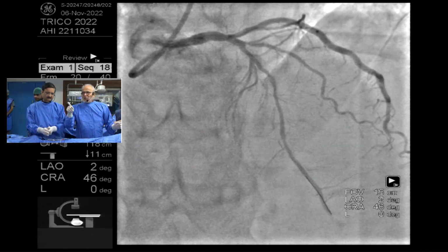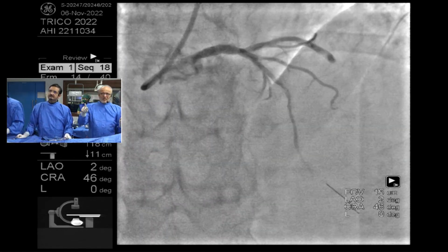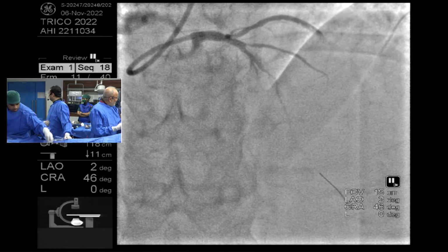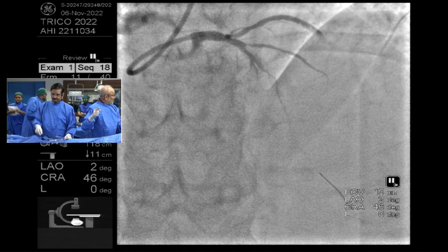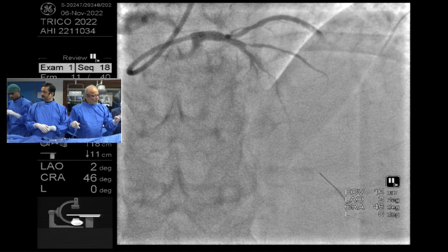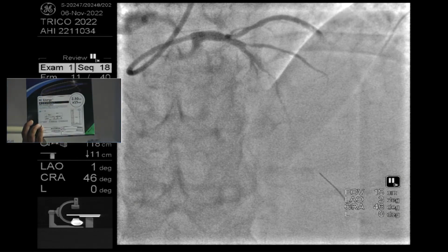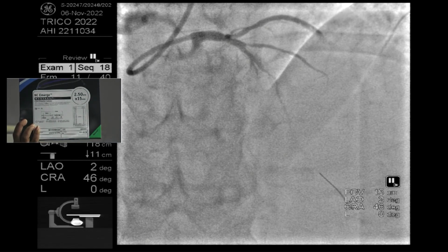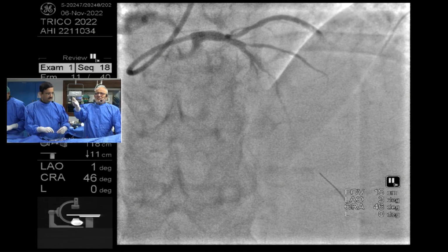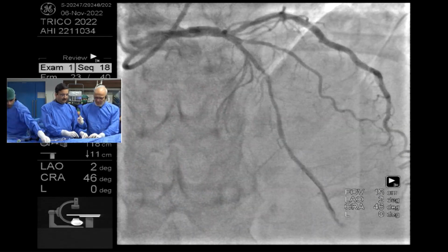But after proper dilatation with non-compliant balloon, we are going to take one OCT run, right, Dr. Akasaka? And then I will do IVL, and then we will see another OCT run. What difference does it make? And then at the final, so 3 OCT runs we are taking. You don't want to do OCT now? No, no. First pre-dilatation. We don't see anything, we will see only calcium and no significant thing, because contrast will not go inside.